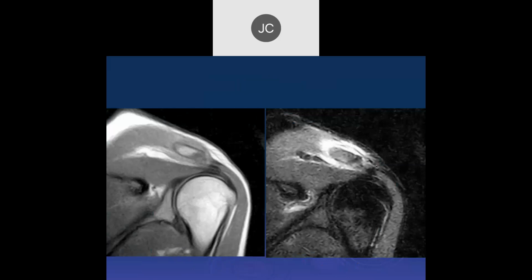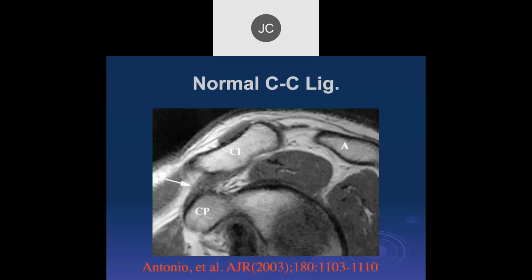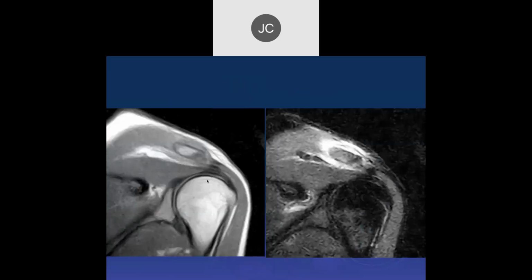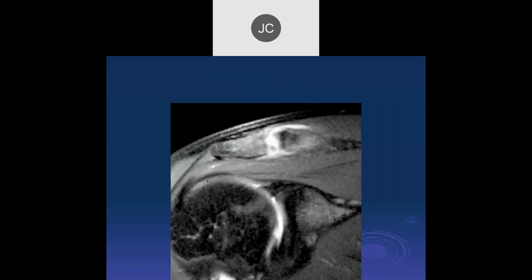Here we can see a situation where we have a lot of edema around the acromioclavicular joint space in this location. The coracoclavicular ligaments were intact. So this would be a Rockwood type 1 injury. Okay. Let's see. Pavan, what do you think of this case? It doesn't look displaced, but there's some edema, so maybe like an AC strain, and so type 1. So you can see a tear here with some fluid extending outside the capsule superiorly. So what's the next thing you want?